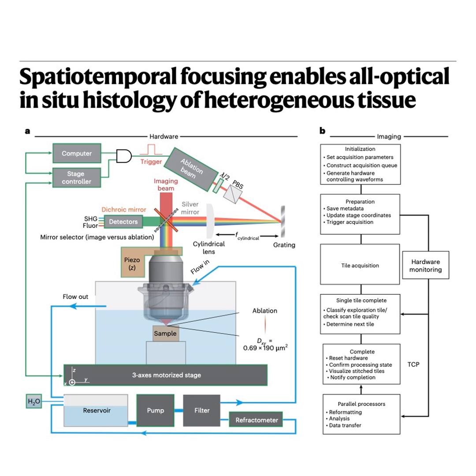Does it just hit them again with the same laser settings? Not quite. The sources mention something interesting here. Residual tissue that's slightly below the ideal target plane, maybe because the first pass wasn't perfectly even, is harder to remove. Right, the laser might be slightly out of focus for it. So for these refinement ablations, the system actually calculates and applies an adjusted higher laser fluence, and this adjustment is depth dependent. It uses an exponential formula, which essentially means the further the residual target Z is below the intended ablation plane, the higher the exponential factor applied to the base fluence. It ramps up the power to ensure it blasts away those deeper remnants.